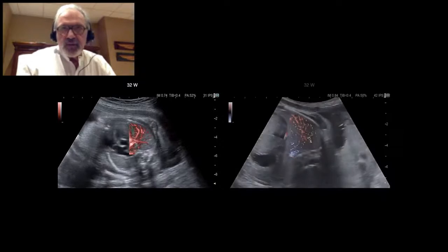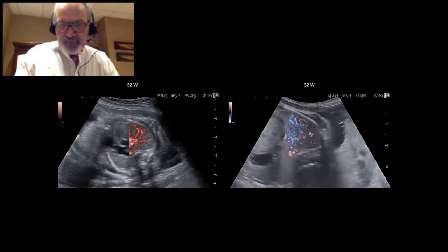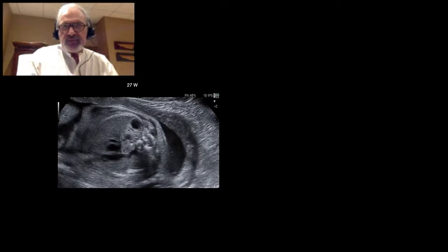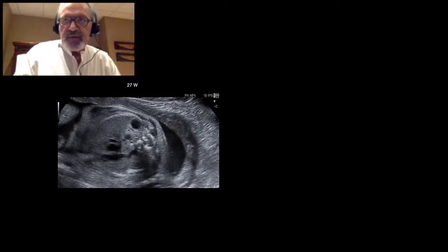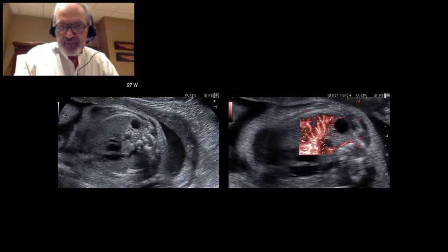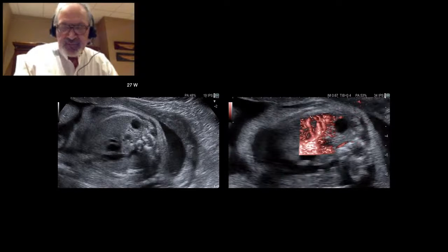Also, in the third trimester, depending on the setting, we can highlight the larger trunks or the small distal vessels, even when the fetus is making breathing movements, like you can see on the right. In this situation, where there is a pulmonary malformation associating cyst and hyperechoic parenchyma, the DFI system shows a poor vascularization in the abnormal territory, as you can see here. So this is compatible with CPAM.